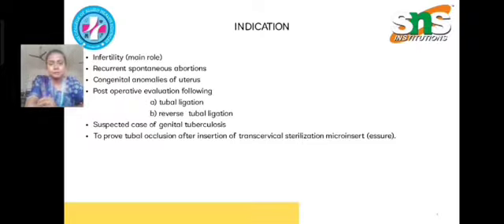been settled inside the uterus. So we have to ensure that it has been cleared, so this procedure will also be done.